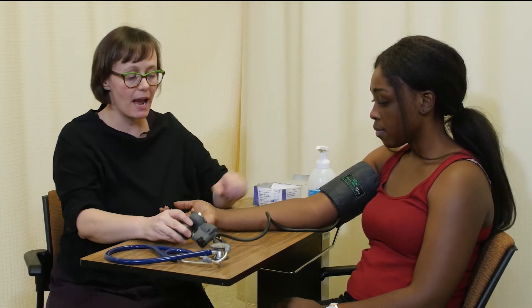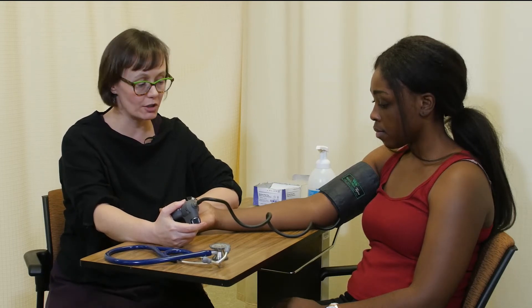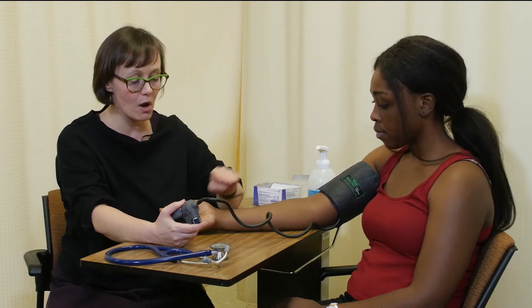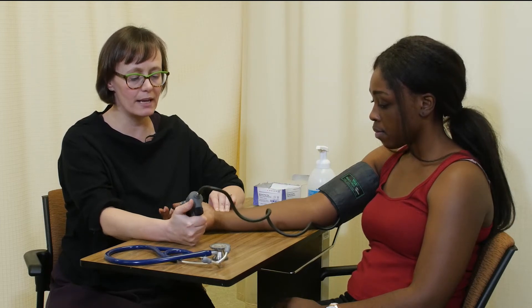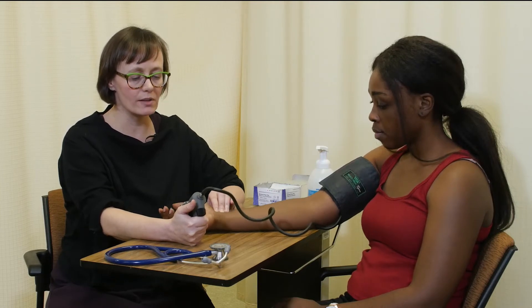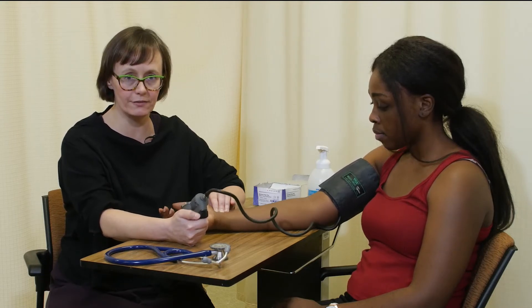Next, I'm going to determine maximum pressure inflation — this is the number I need to inflate the cuff to when I take blood pressure. To determine maximum pressure inflation, you can palpate either the brachial pulse or the radial pulse. I'm going to palpate the radial pulse. I'll close the valve and inflate the cuff fairly quickly until I can no longer feel the pulse. I obliterated the pulse at 100, so I'm going to continue 30 millimeters of mercury beyond that to ensure it's obliterated, which it is at 130, and then I quickly deflate the cuff.